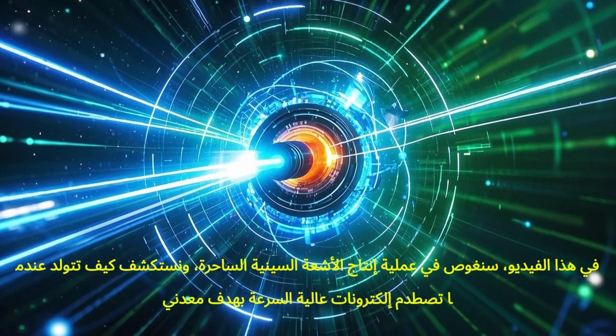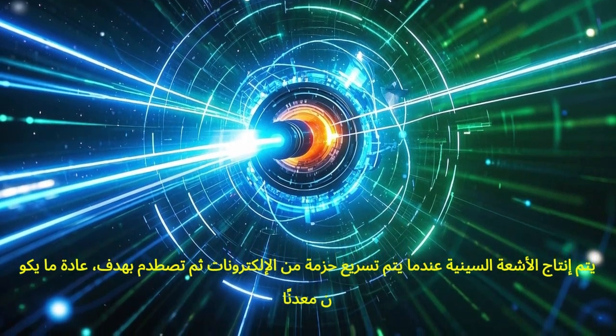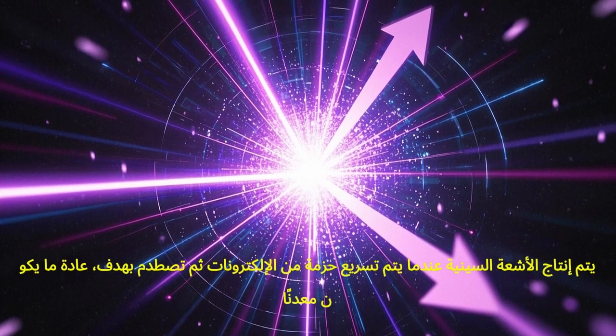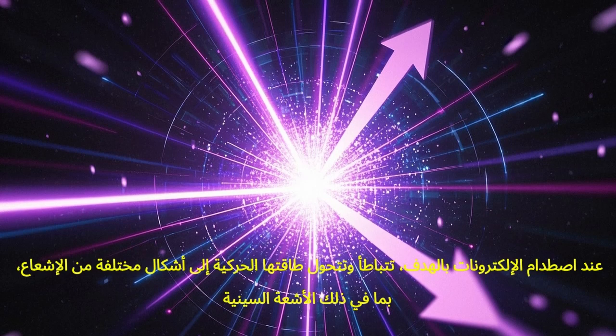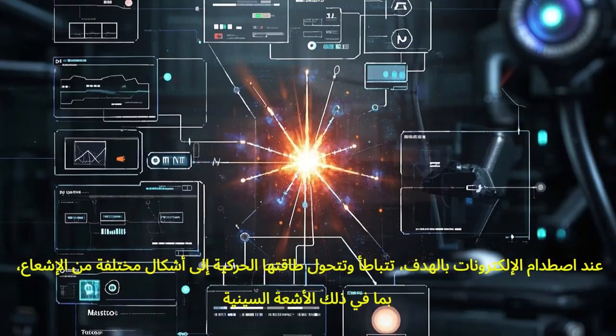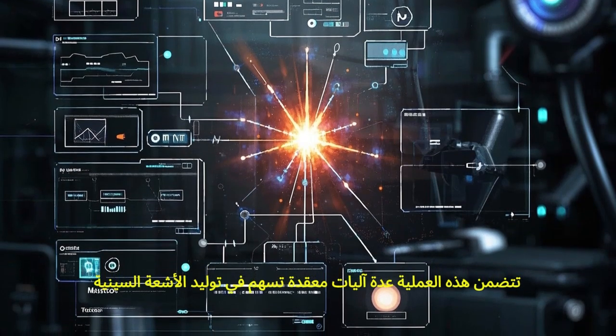X-rays are produced when a beam of electrons is accelerated and then strikes a target, typically a metal. As the electrons collide with the target, they slow down, and their kinetic energy is converted into various forms of radiation, including X-rays. This process involves several intricate mechanisms that contribute to the generation of X-rays.